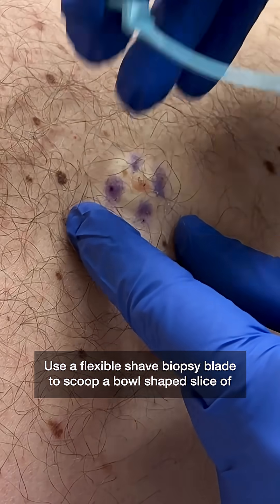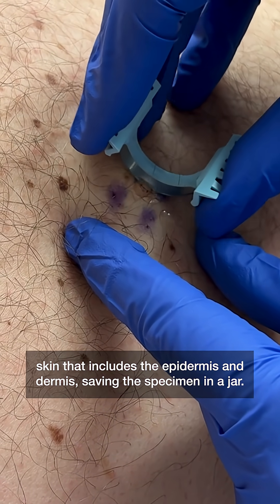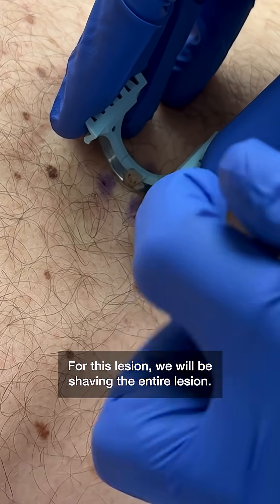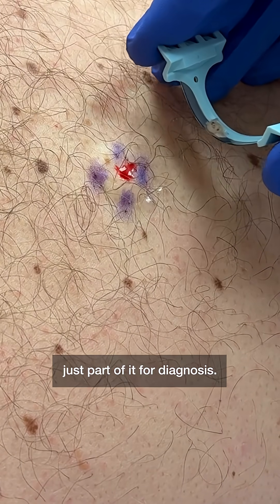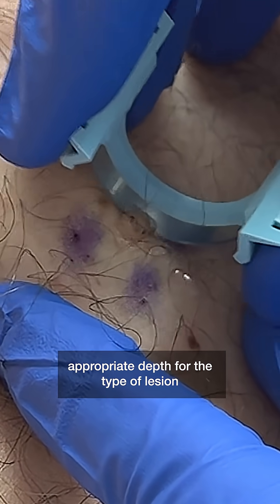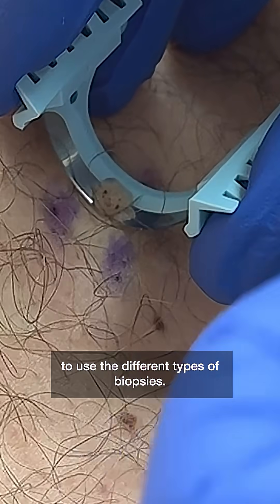Use a flexible shave biopsy blade to scoop a bowl-shaped slice of skin that includes the epidermis and dermis, saving the specimen in a jar. For this lesion, we will be shaving the entire lesion. For other lesions, such as large lesions, you might shave just part of it for diagnosis. Training to perform skin biopsies includes learning how to get the appropriate depth for the type of lesion being biopsied and when to use the different types of biopsies.